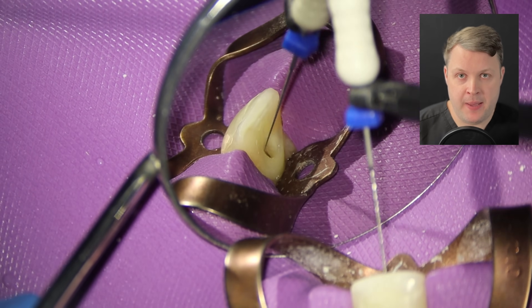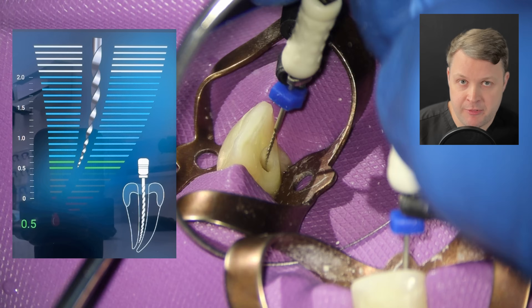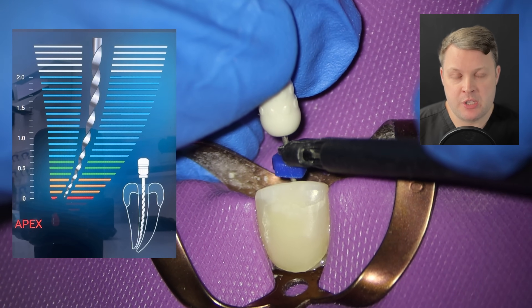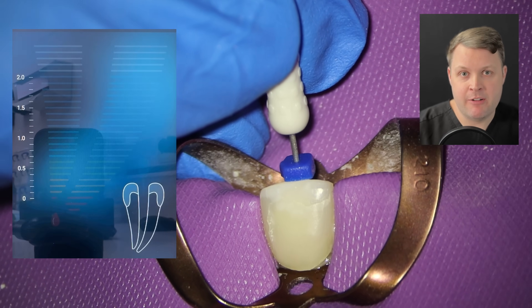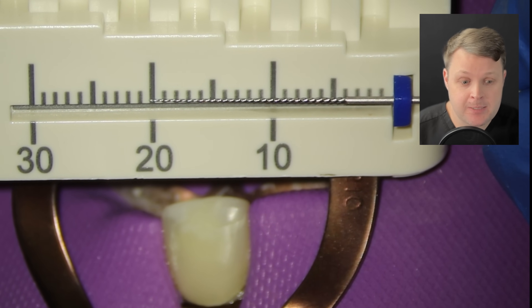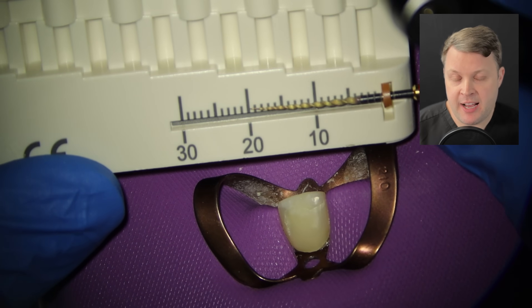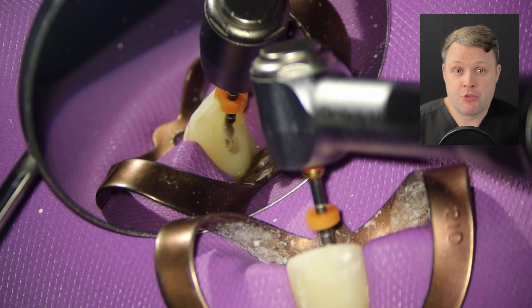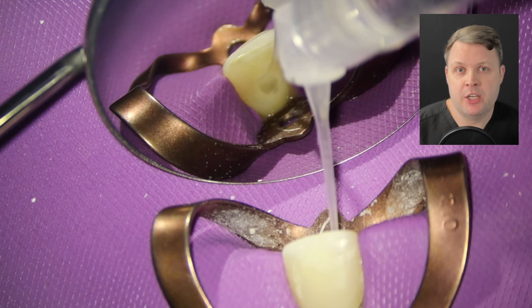Once the tooth is accessed, the apex is really wide, so I'm going to go straight for my working length measurement with my apex locator using a size 15 K file. As I've said many times, I push the K file through the apex until the apex locator screams, then back the file up until I hit zero — that is my zero reading. When we pull it out, the working length is found to be 20 millimetres. I'm not going to bother with glide path files as the canal is really large; I'm going straight for my shaping files, using the Hyflex 25, measuring 0.5 millimetres away from the zero reading. The rotary file drops straight down to working length really easily, but I'm getting a little friction, so I know I'm shaping it and don't need to increase shaping sizes.